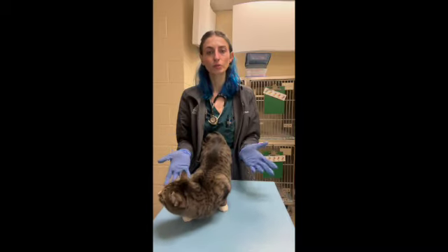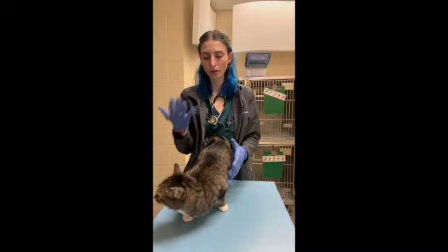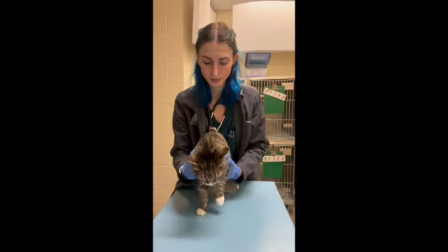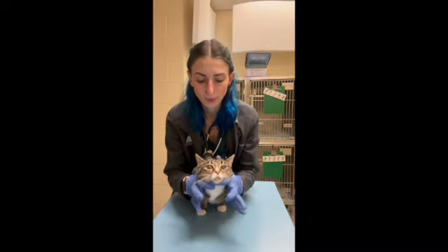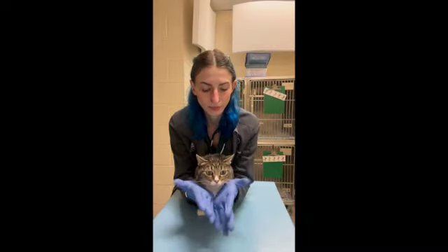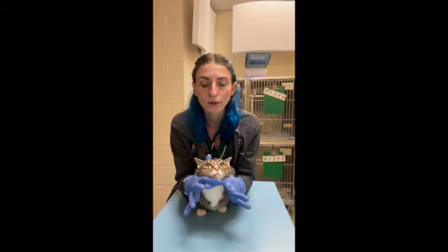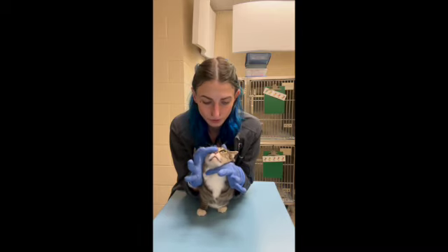Restraints for obtaining our blood samples. So I'm going to go ahead and start demonstrating a jugular blood draw. Typically I like to have my patient in a sitting position. What I'm going to do is take my thumbs and place them behind her ears. And then I'm going to take my hands and put them in a kind of triangle, and grab her chin from both sides. And then for the patient drawing blood, I'm going to hold her this way.